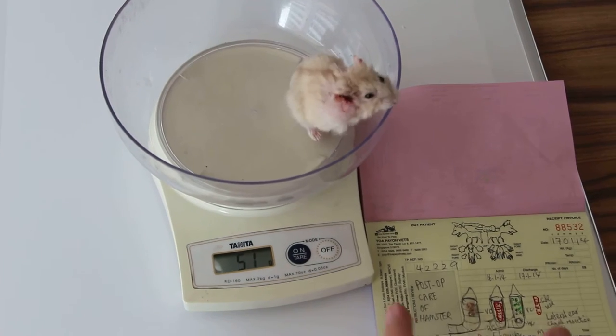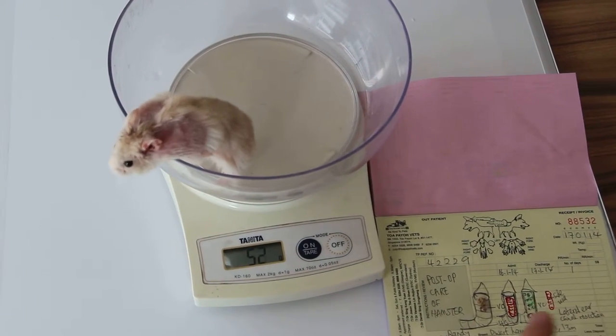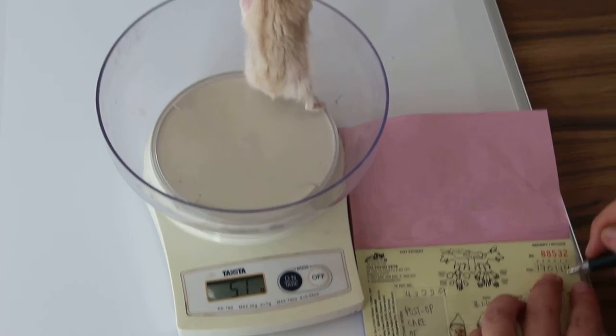First of all, we weigh the hamster the second day after surgery. The hamster's weight is then recorded. Yesterday before surgery it was 58 grams; now it's 52 grams.